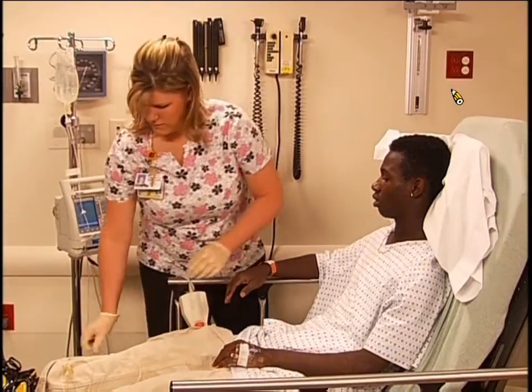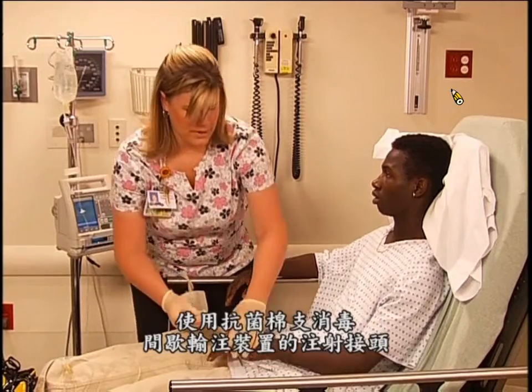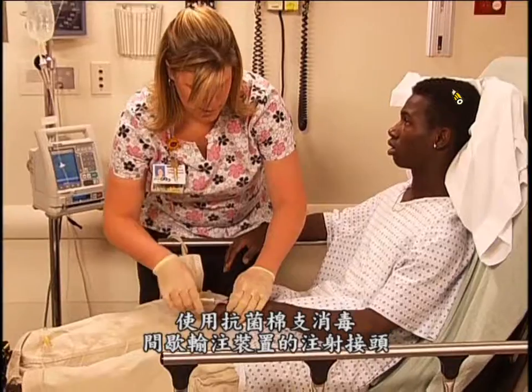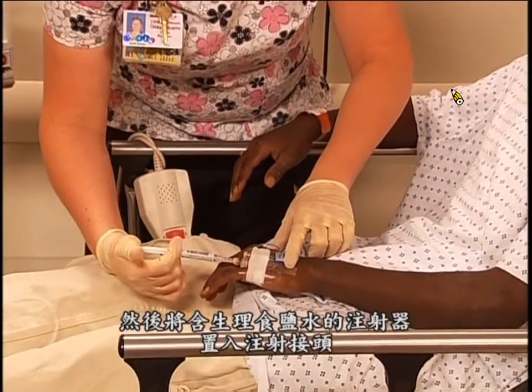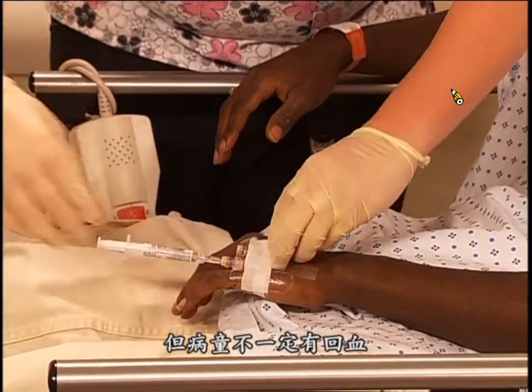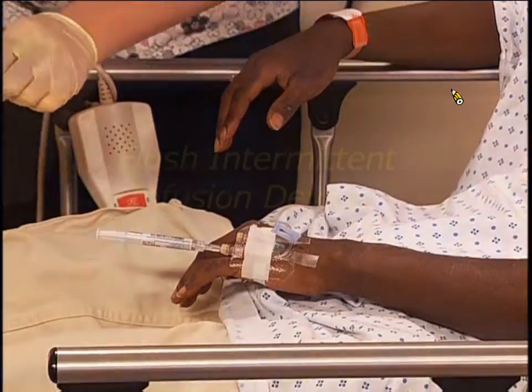So first what we're going to do is, using an antiseptic swab, clean the injection port on the intermittent infusion device. Then insert a syringe of normal saline into the injection port. Gently pull back on the plunger and watch for a blood return, which may or may not occur in a child. Now we're going to clean again and then give your antibiotic.